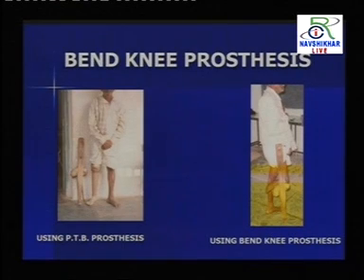यू कैन सी दैट गांव में तो इट्स वेरी कॉमन कि अपने क्रच के ऊपर ही दे डू द अमेंडमेंट इन द क्रच इटसेल्फ. क्रच के अंदर बैसाखी के साथ ही नी के लेवल पे नी को मोड़ के एक प्लैंक लगा देते हैं, उसके ऊपर अपना नी रेस्ट करके दे मेक देमसेल्फ वॉक. अब नहीं होता है तो हिप को रेस्ट करने के लिए एक लकड़ी लगा देते हैं और वो उसके साथ भी चलते हैं. So these are the things that are being adopted by the local people also.